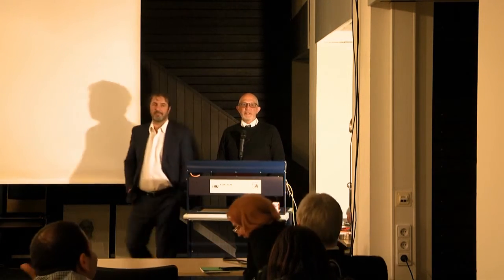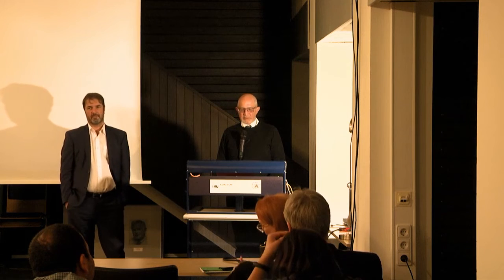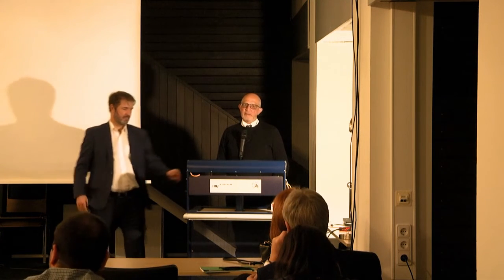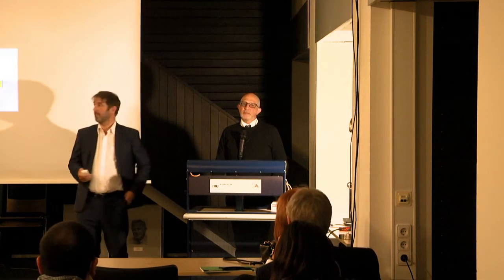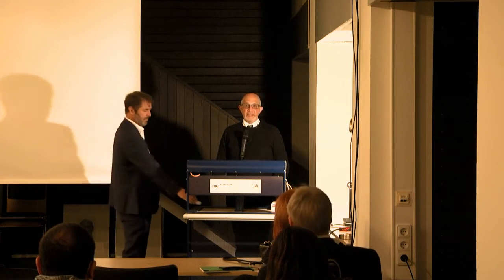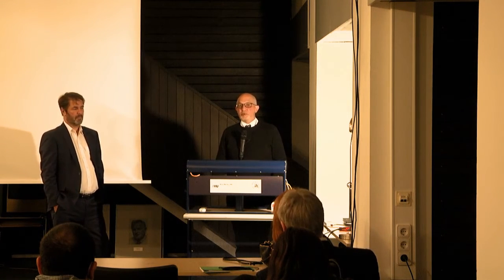Thank you, Conrad. I also enjoyed the talk very much, and I've got a question. We've got a growing number of, especially young women, who have multiple hypoechogenic lesions, and if you add contrast media, they are hardly perfused in any phase. We biopsied some of them, and it was sarcoidosis all over. We're a rheumatology unit as well, but what's your experience? In my impression, it's more and more. I think granulomatous disease of the spleen and sarcoid is underdiagnosed. It's only because we image more and more that we see it.